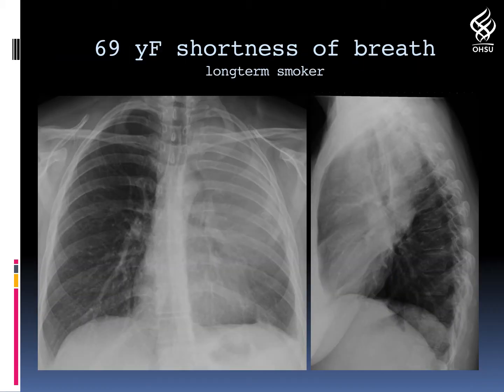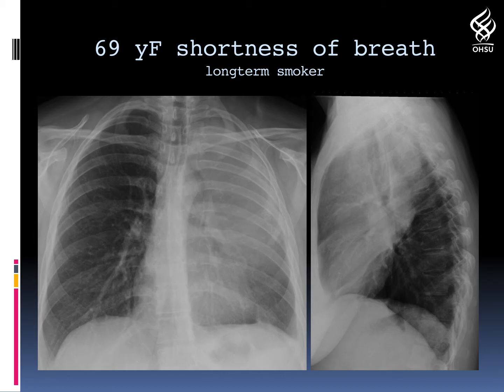Another case: a 69-year-old female who presented to our institution with shortness of breath and a long-term smoking history. You can see an almost complete opacification of the left upper lobe. On the lateral radiograph it is not collapsing — in fact it has bulging fissures, meaning the fissure is bulging outward, which tells us that there is a space-occupying process ongoing. The patient was not febrile and did not have an elevated white count. This was in fact a large left upper lobe lung cancer with associated adenopathy, as seen by the density surrounding the left main bronchus on the lateral radiograph.